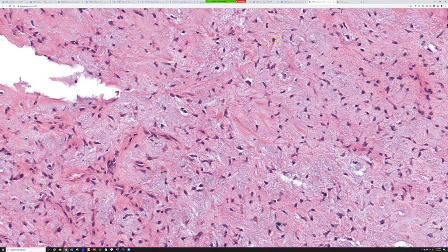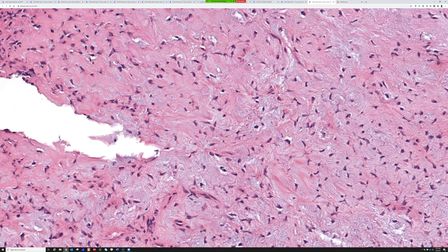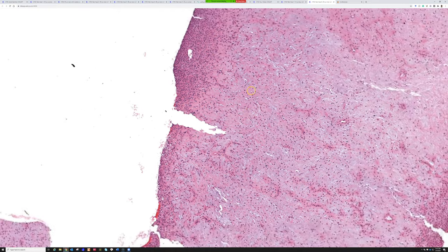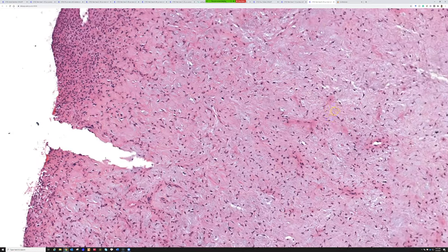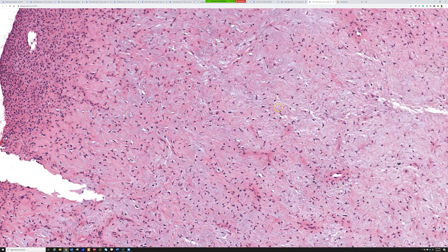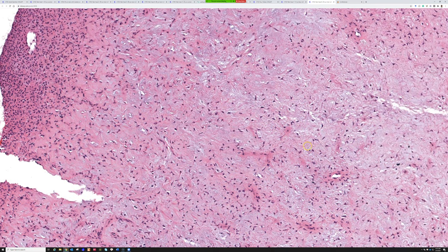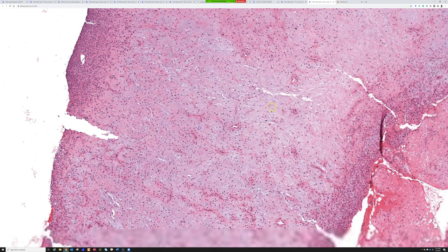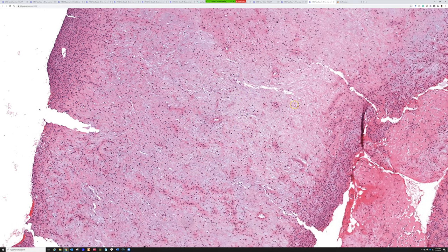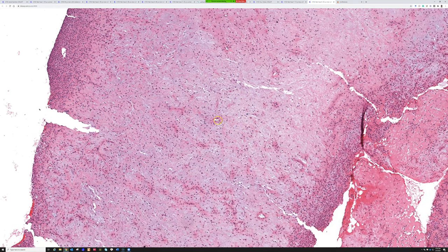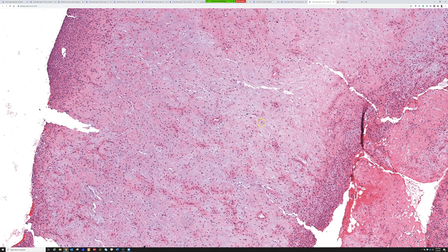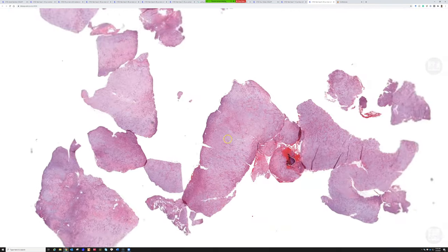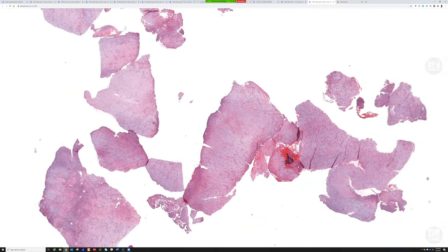See how they're flat at one end and then long and pointed at the other? Ever since he pointed that out, I think that's a really helpful feature. The triangle-shaped cells are hypocellular in the middle with a lot of myxoid and sometimes pink sclerotic collagen or more pink dense matrix in the background.